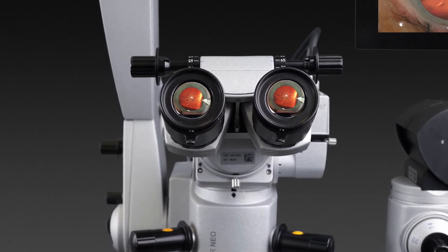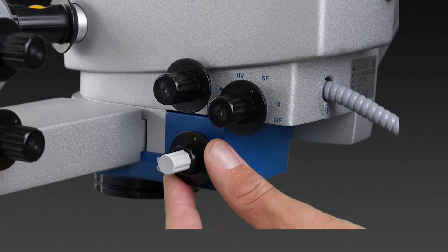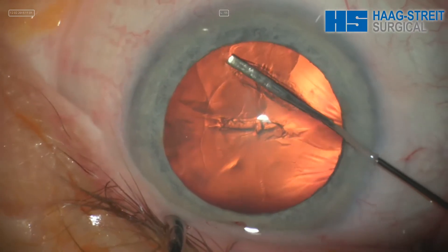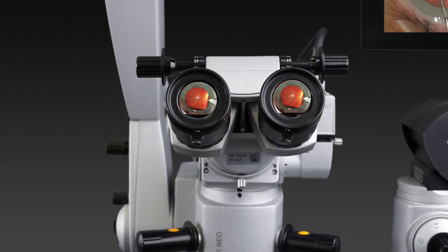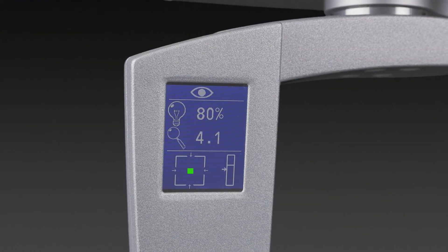The integrated red reflex enhancer shows all details during capsulorhexis and polishing of the capsular bag. The red reflex enhancer can be individually adjusted to always achieve a perfect red glow, as well as switched off for corneal surgery. The microscope's integrated display gives instant feedback on all important settings.